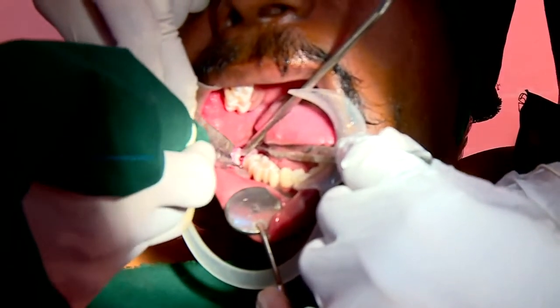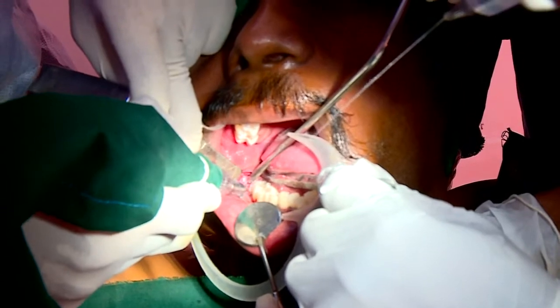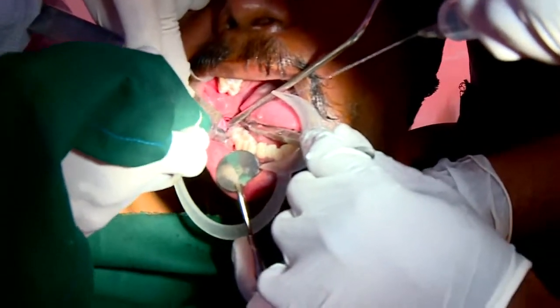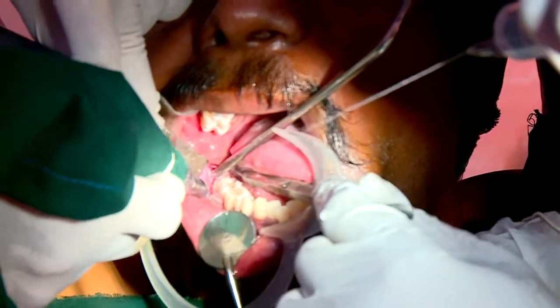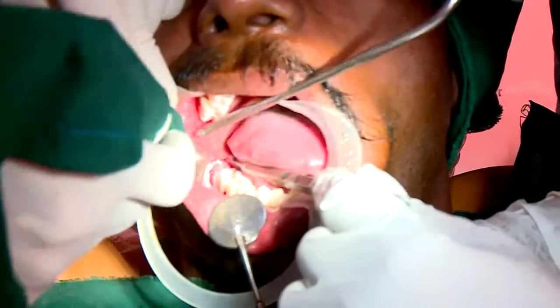Good attention is required. Remember the patient has around 1 hour of anesthesia for the tooth.